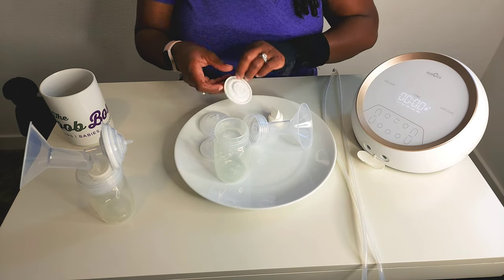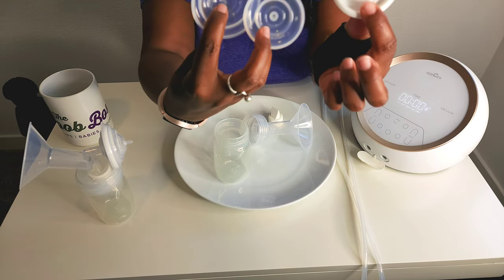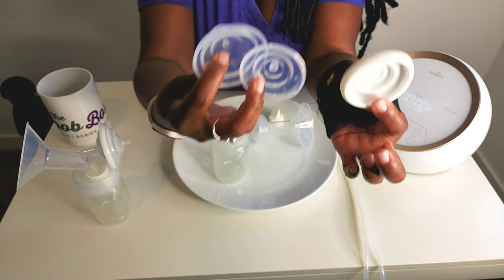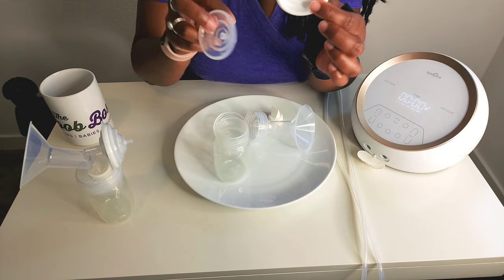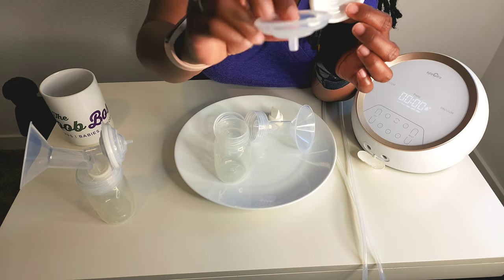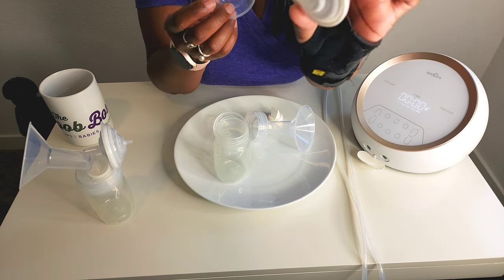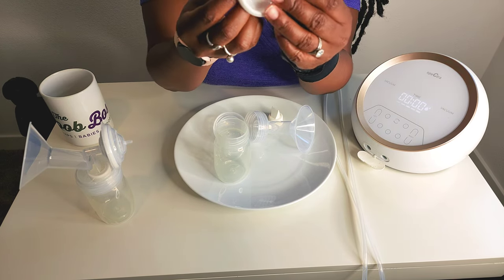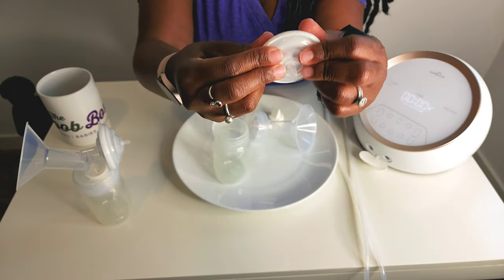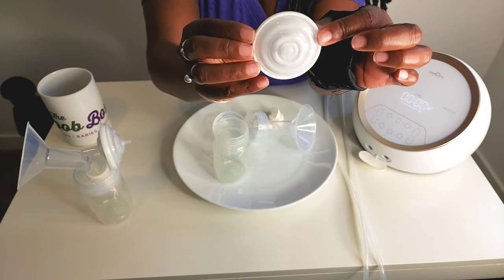And then you've got your backflow protector. It comes in 3 pieces. This is going to be your backflow protector. This is what is going to prevent milk from coming into your tubing. How you put this on is also really important. I've got some lint on here. So you've got the smaller part of your protector, the smaller disc. This is where you're going to want to slide your little rubbery disc over first, and you will actually hear it snap into place. You want to make sure you've got it all the way around, nice and snug.